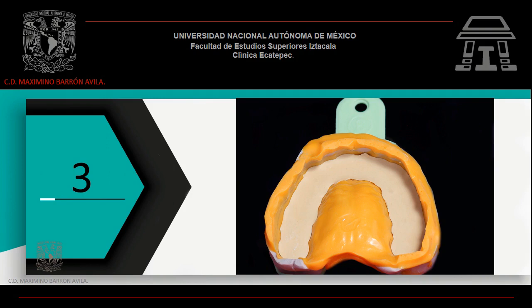Corre tu impresión con yeso tipo 4 hasta la línea que marcaste en el paso anterior. Permite que el yeso termine su proceso de fraguado. Retira tu impresión con cuidado. Recuerda que las dimensiones del modelo son pequeñas y puedes fracturarlo al momento de retirarlo de tu impresión.